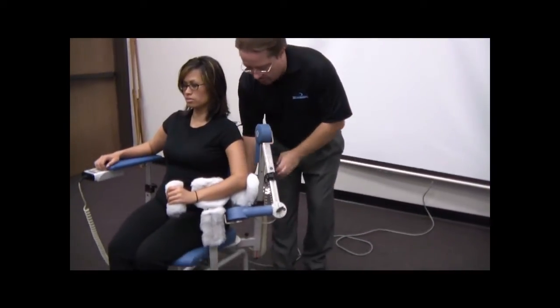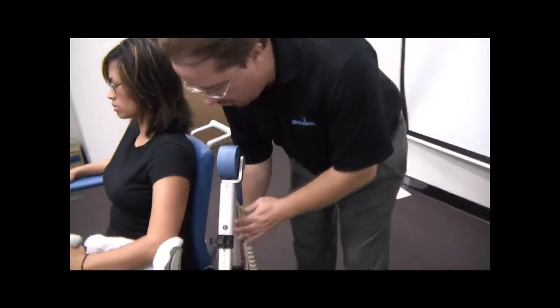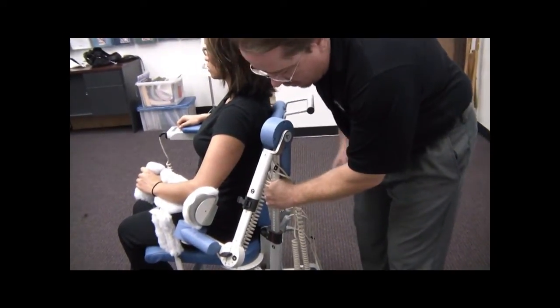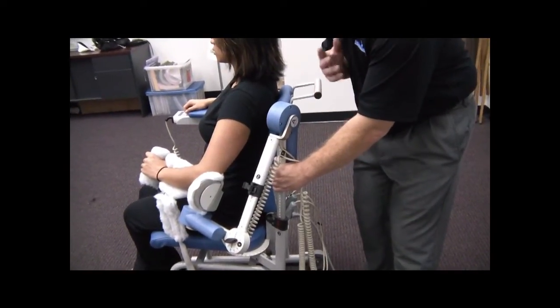Okay, so what I'm going to do is I'm going to come around here and I'm going to loosen the A motor. Now, anytime we loosen this A motor knob down here, we have to hold on to this. If I loosen this and I don't have a hold of this, it's going to drop. And if you have the patient's arm in there, that's going to be bad.